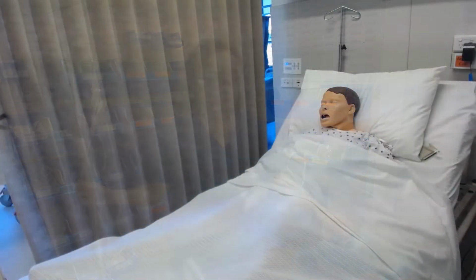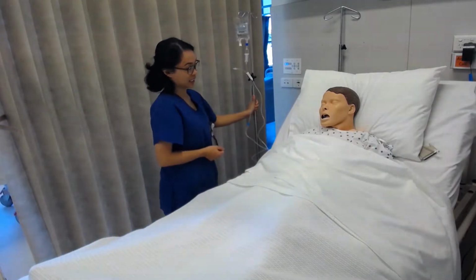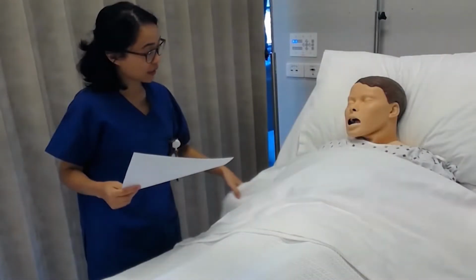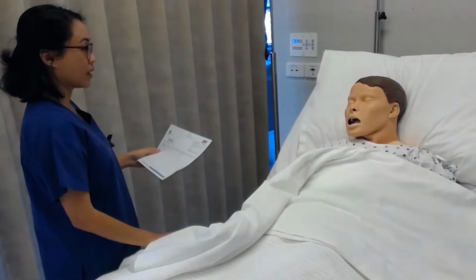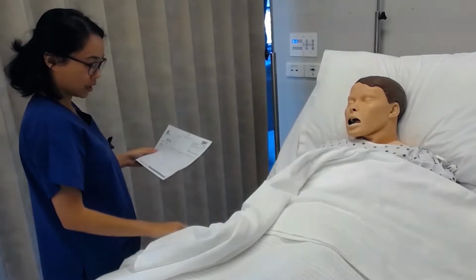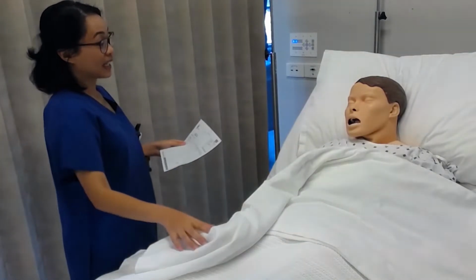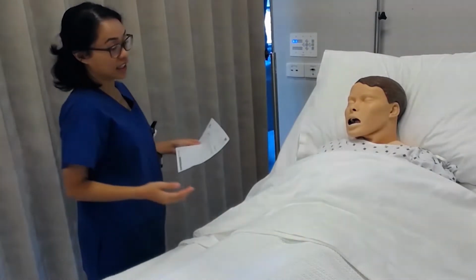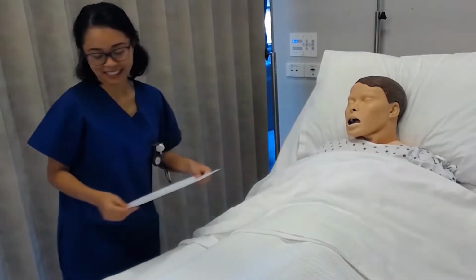Upon entering the patient's bed space, ensure that you complete the 5 moments of hand hygiene, and you can now do your third check of the 5 rights. This third check must be done at the patient bedside and must include a patient identity check. So ask the patient to state their full name and date of birth, compare this to their armband and their medication chart, and check their MRN.